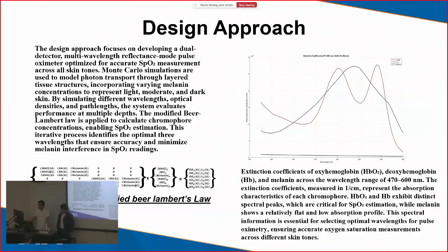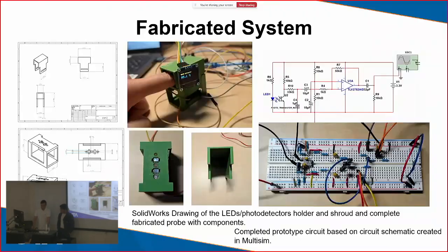Last semester we initially only wanted to account for 2 wavelengths. With the jump to 3 wavelengths and 2 detectors, our design had to change a bit to account for the extra space needed. This also put a pause on our PCB design, so it is a little messier than we thought it would be. This is our new design.